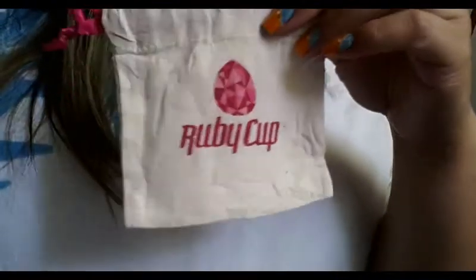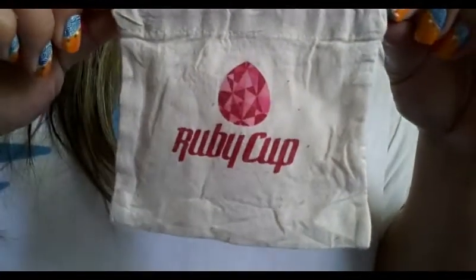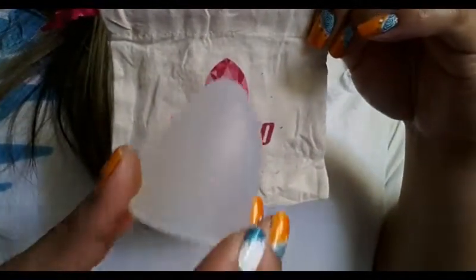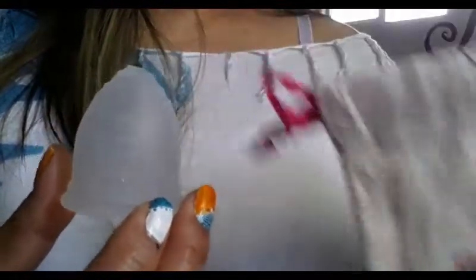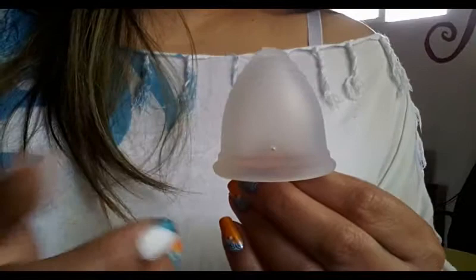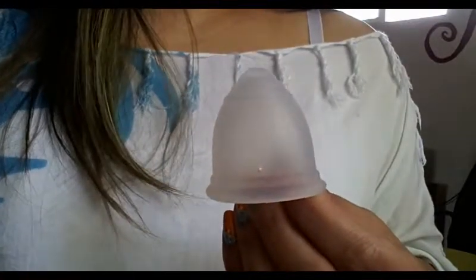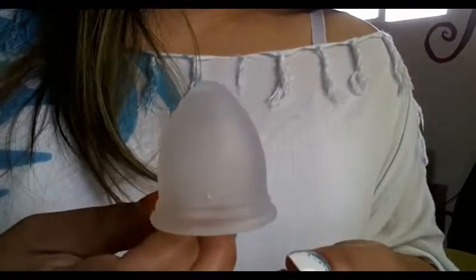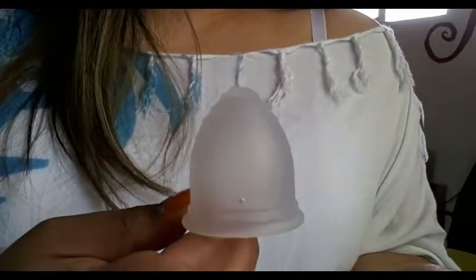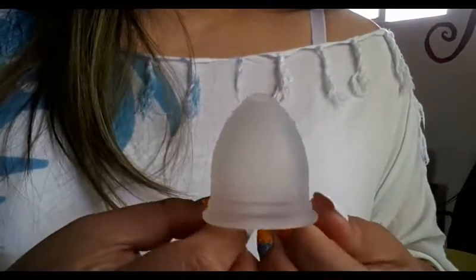Now I'm going to talk about the Ruby Cup. The Ruby Cup is from a company that was originally in Germany and now they're based in Berlin and Kenya. According to their website they do use 100% medical grade silicone, and they have this really awesome concept called the buy one give one — every time a Ruby Cup is purchased from their website or one of their other vendors, they give a cup to someone in need in Africa. That's an awesome concept and a great feeling to know that you're buying from a company that is reaching out to help other people and it's not just all about the money for them.